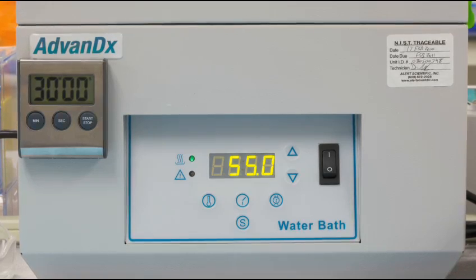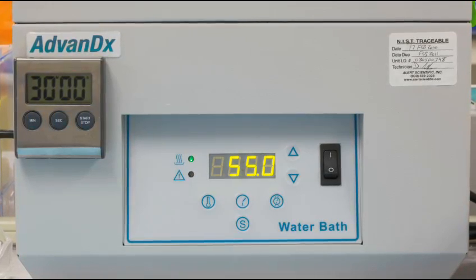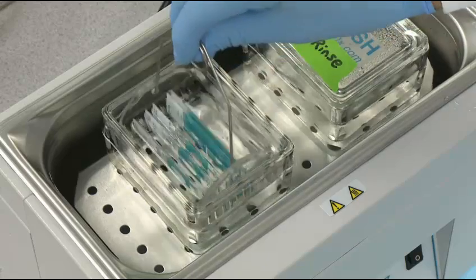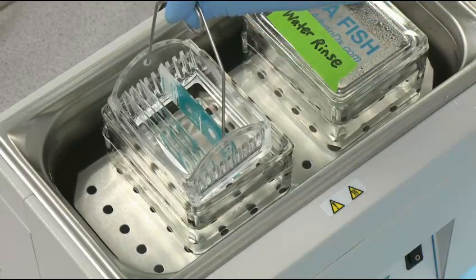Wash slides at 55 degrees for 30 minutes. After the wash, remove the slides and allow them to air dry.